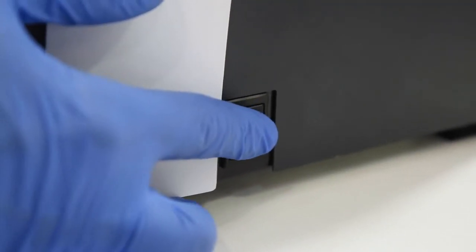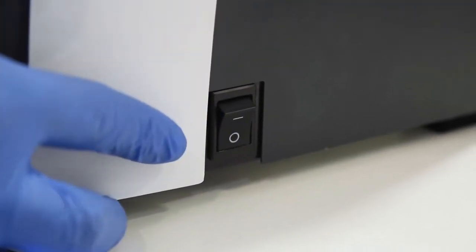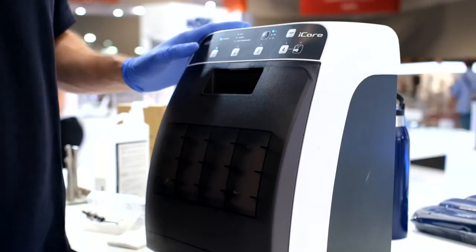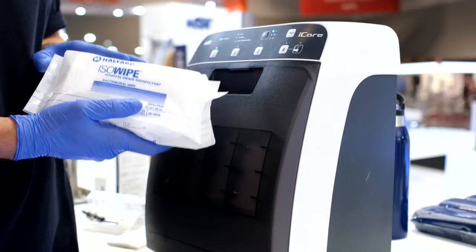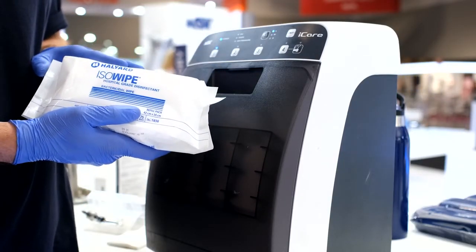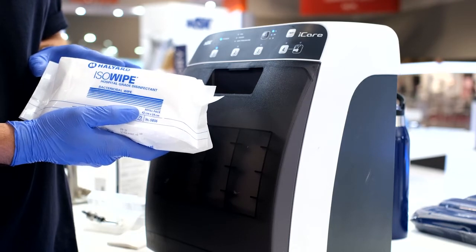Before cleaning the iCare, first turn off the power switch and remove the power cord from the unit. Wipe the unit with a cloth moistened with water, warm water or soapy water, then wipe again using neutral detergent or alcohol wipes.